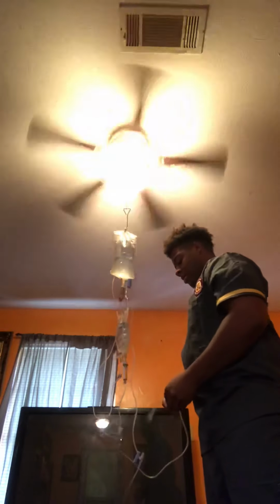Next thing you want to do is prime it. So I'm just gonna hang it right here on this lower one and squeeze this to get some in there, halfway.